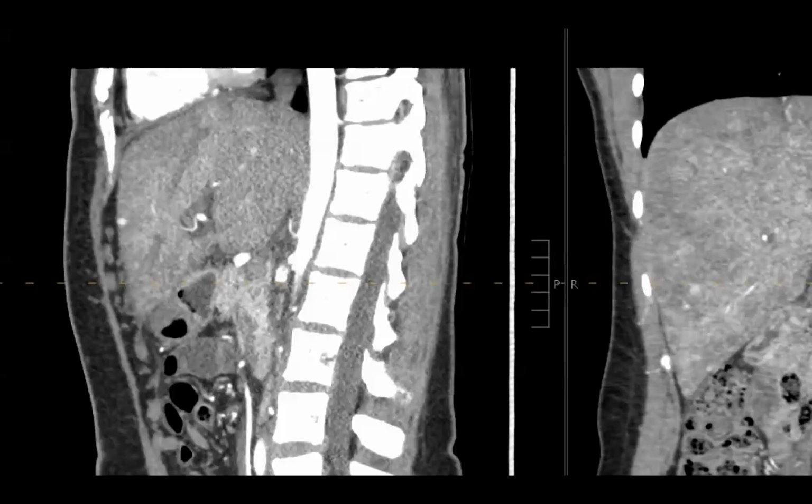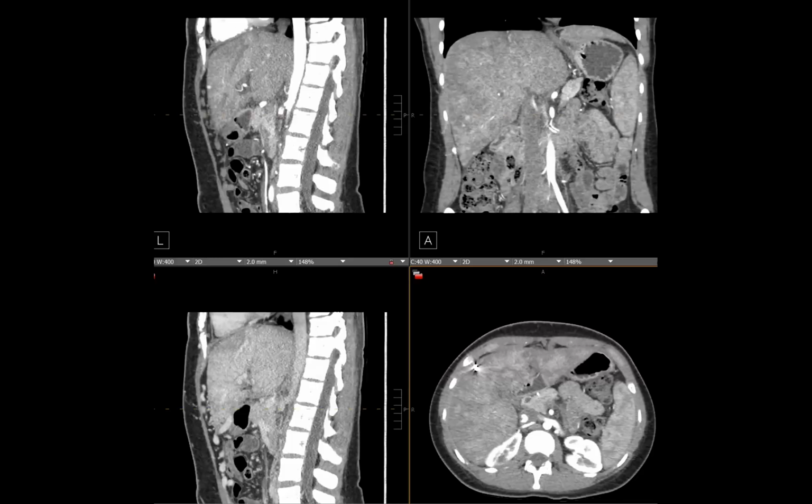Have you used it for appendicitis? Or just in general? Not just in general. Oh, cool. It's actually great when we do MREs to look for inflammation, at least to prove that you're right when you're calling something abnormal on the post contrast. So it's specific. It's specific, yeah. Not always very sensitive, but it can be quite specific. Cool.